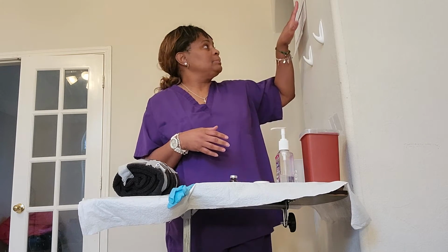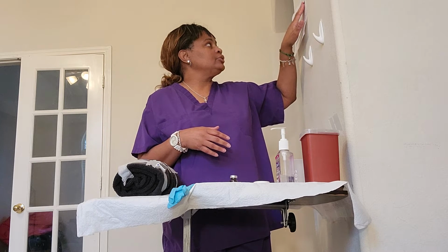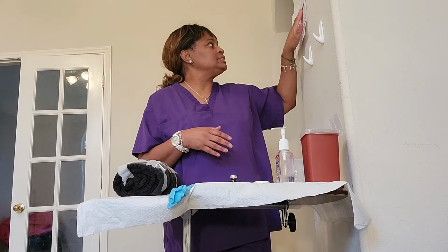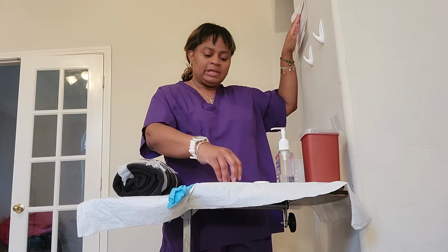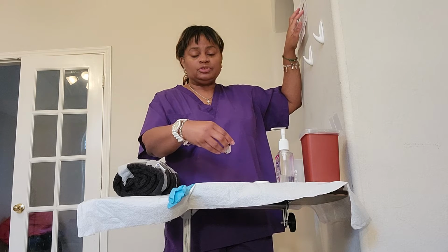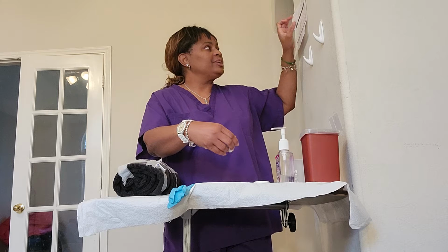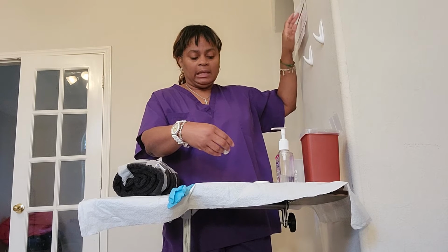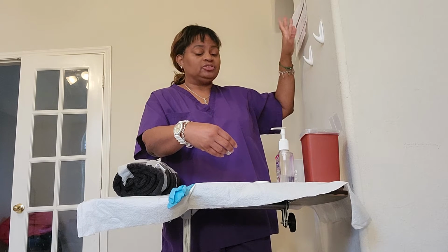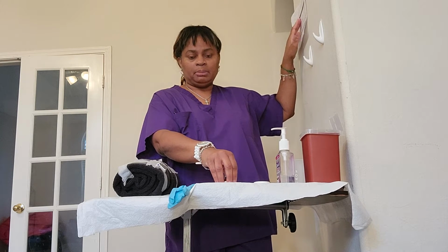Okay, the patient's name is Millie Larson. Her date of birth 1/1/1936, MRN 123456. She has no known allergies. The medication that we are giving is the furosemide. It's going to be 20 milligrams, which is 2 mLs, and we're going to give it over a 2-minute period. The time to give the medication is right now, and she's not allergic to any medication, and the medication is being given for edema and blood pressure.